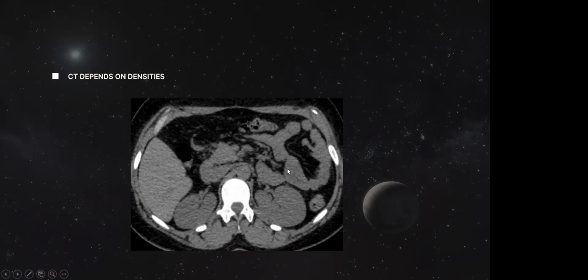If you are only looking for a hemorrhage or a fracture, the CT is an excellent modality. But if you are looking for multiple sclerosis or demyelinating diseases, or you want to characterize tumors, you need to go for the MRI.